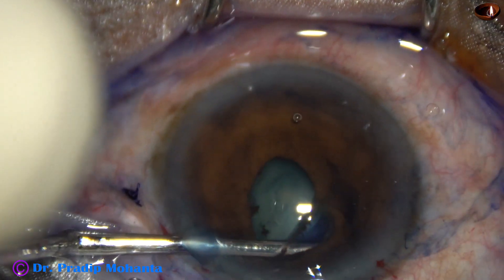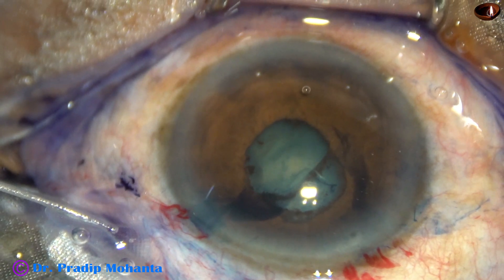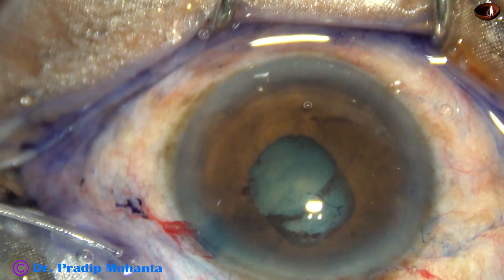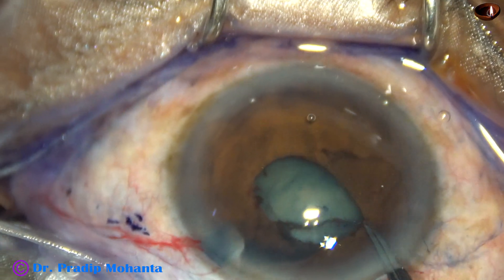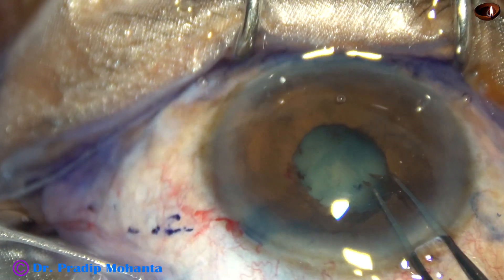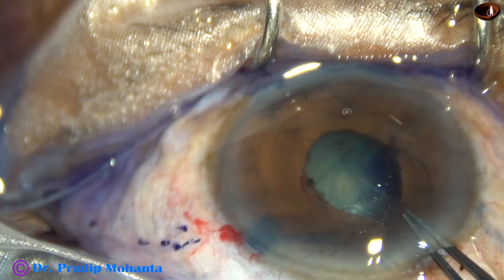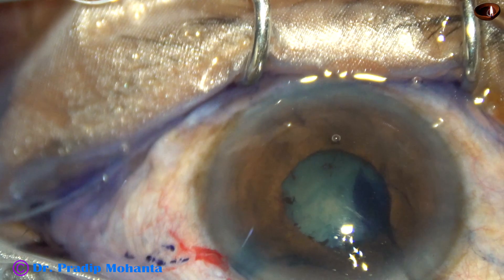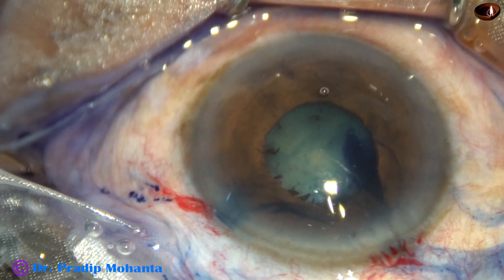I go through the side port and break the rest of the synechia, and visco is again injected. You can see there is a fibrous tissue ring around the pupil. I am using a capsulorhexis forceps to remove this fibrous tissue ring. It got torn and it is coming piecemeal. Yes, so it has come out.